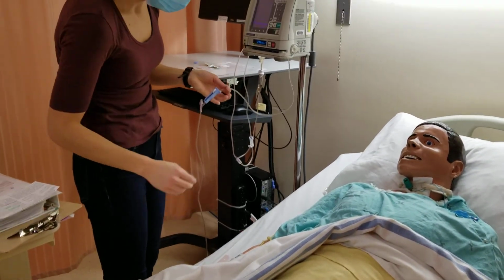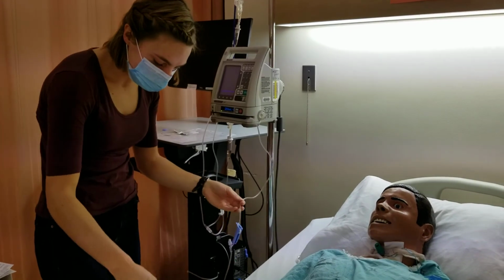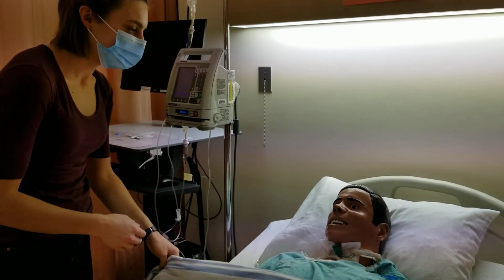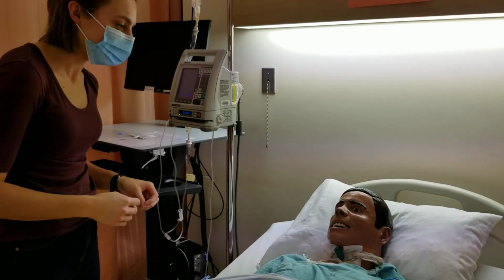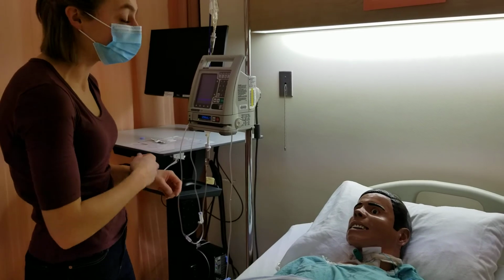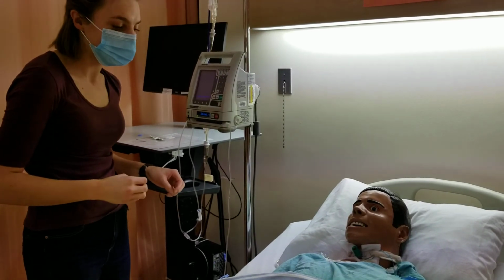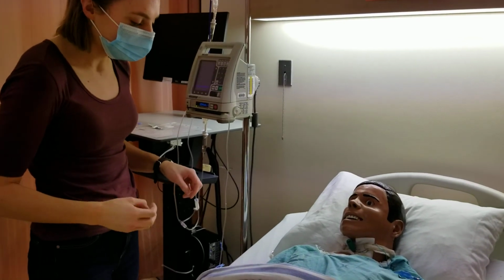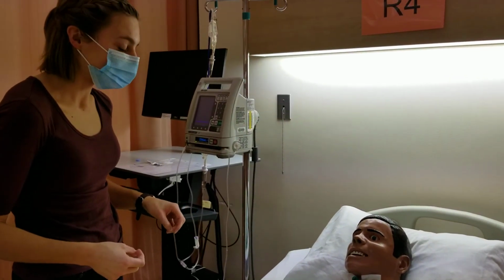Clamps are open. Okay, there. I'm going to be back in 15 minutes when your infusion is done, and program a 15 ml flush to make sure that all the medication is out of the line, 15 ml normal saline. And I'm going to be monitoring for resolution of the infection.